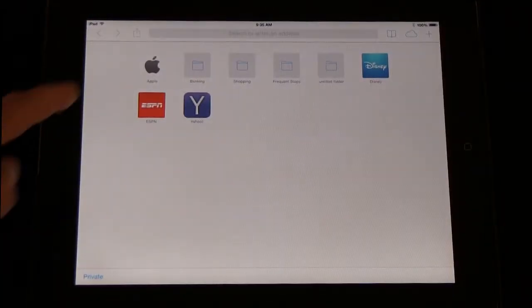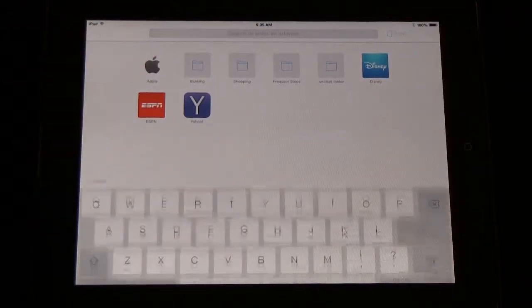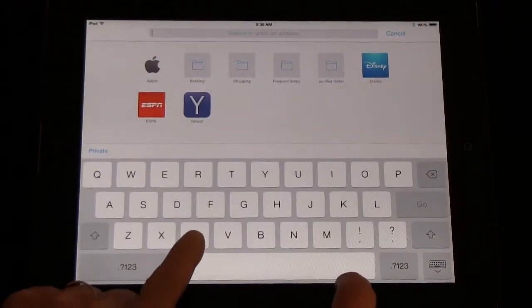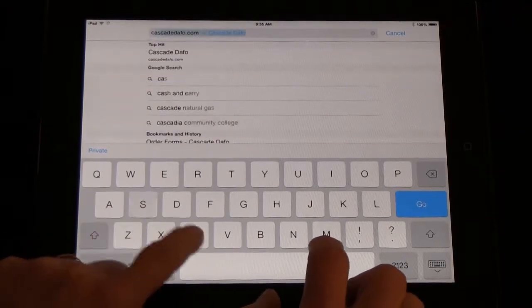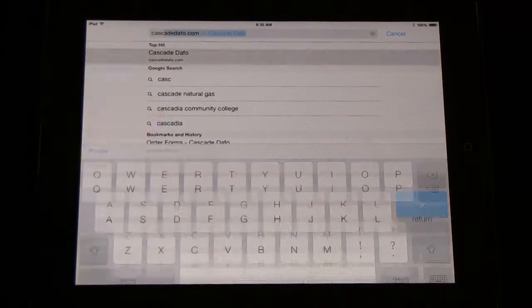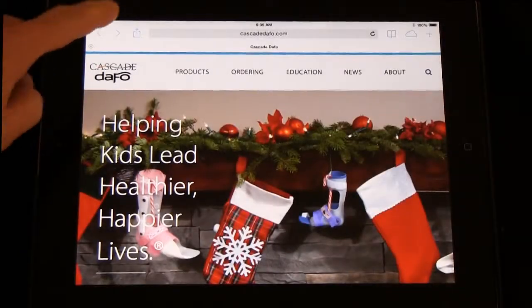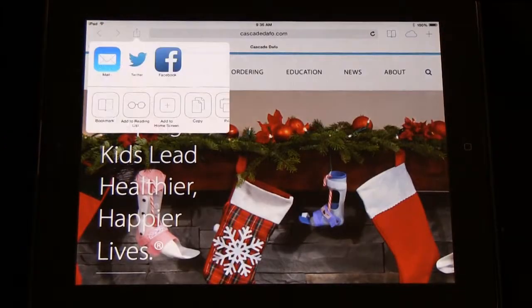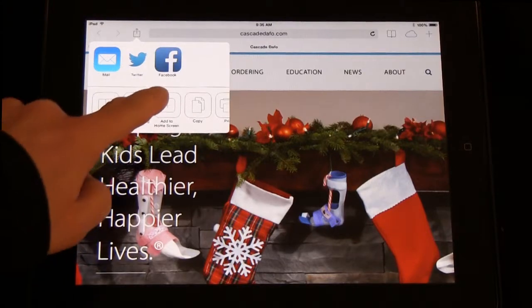Open Safari and navigate to the Cascade DAFO website. You can add our website to your home screen as a shortcut if you like.